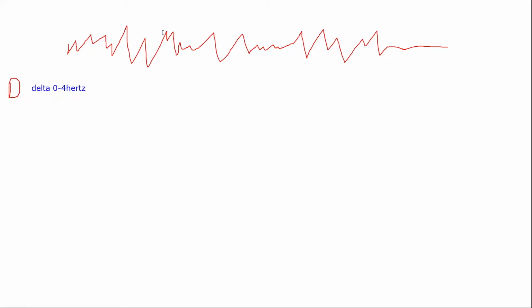So in these delta waves, what that means is, in a 1 hertz delta wave, it does 1 sine wave in a second. Okay, so that would be a 1 hertz or 1 sine wave in a second, which is referred to as a delta wave. Also included in delta is a 2 hertz. So it has 2 sine waves in 1 second. That would be a 2.